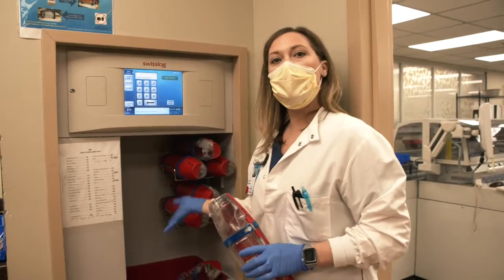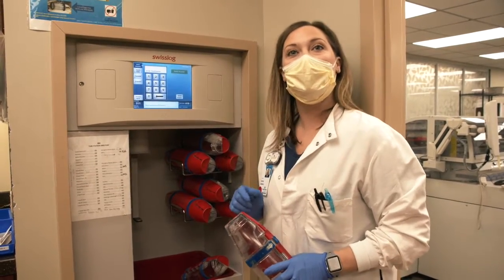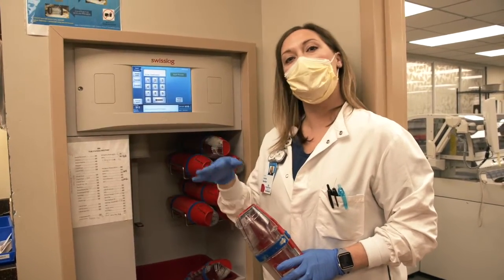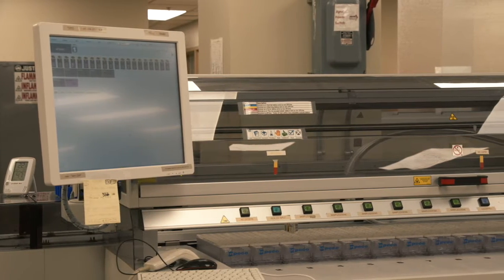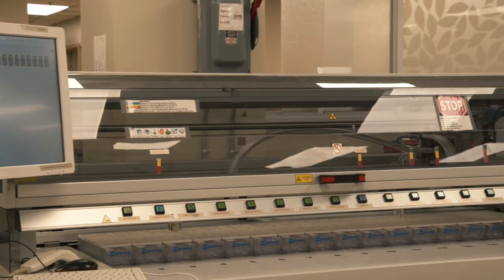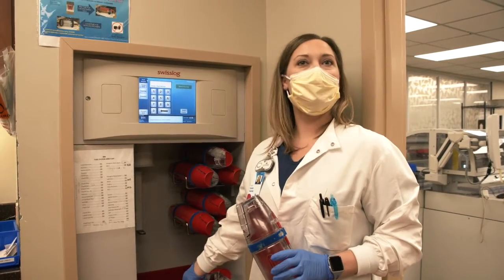So we receive all of our specimens here at the tube system, the majority of our specimens that are in-house. So cancer centers, CHF clinic, any of the inpatients on the floor, the outpatient draw station, everyone sends their specimens through the tube system if it's not a critical specimen that they have to walk up. So this is constantly being, specimens are constantly dropping.